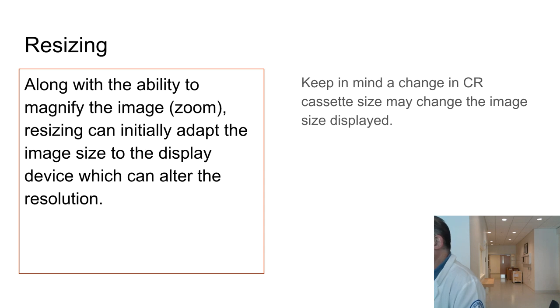We can do a lab within the lab. Who wants to volunteer? I need two quick images of a hand, one on a 14-17, one on a 10 by 12, and then display them side by side. Go for it. Oh yeah, you could each do one. That'll make it even faster. Someone use a 10 by 12 and someone use a 14-17 though.